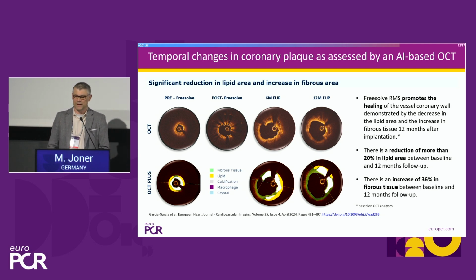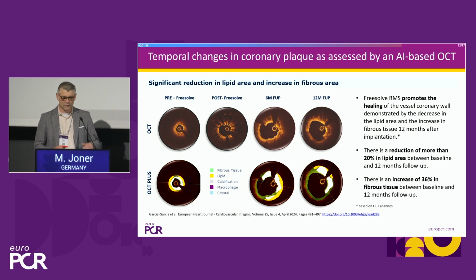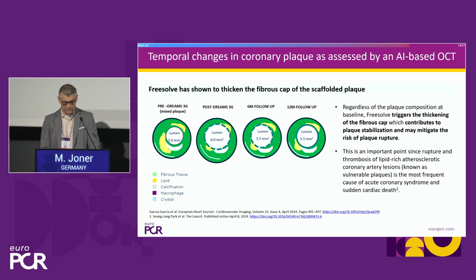One of the dreams that we were eventually thinking of is that you can cap such more progressive, let's say, vulnerable lesions. So this doesn't account for all the lesions we're looking at, but in these vulnerable lesions, it may be an important point. And he shows this here, that it's especially growing on top of the stent struts.